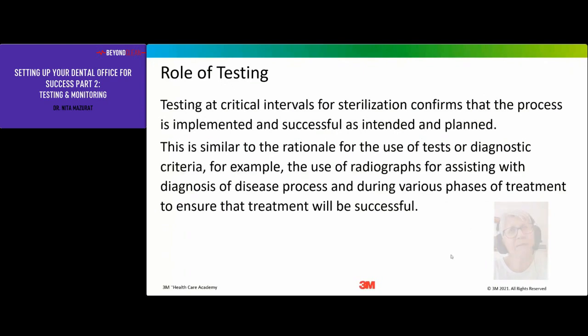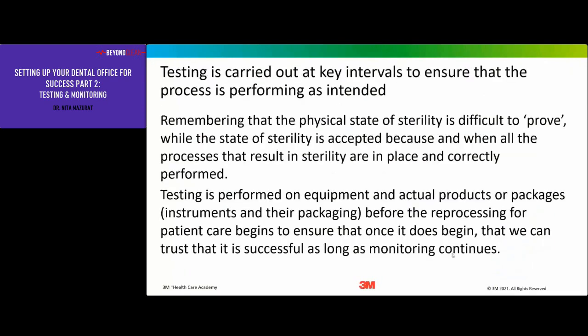And it's the same with sterilization. It's not just pushing a button and hoping that everything will be fine. We need to make sure that we test it first to make sure that it's fine, at key intervals, to ensure that the process is performing as intended. In other words, we're going to have an endpoint of sterility so that we have instruments and devices that are safe for patient use.